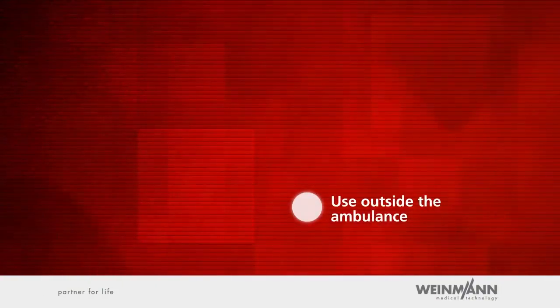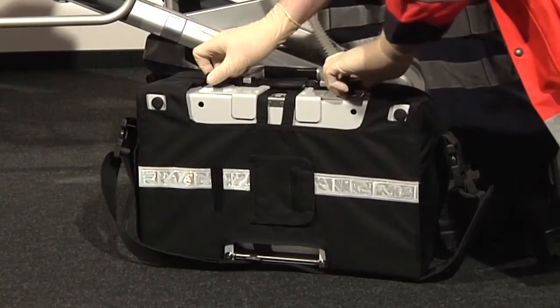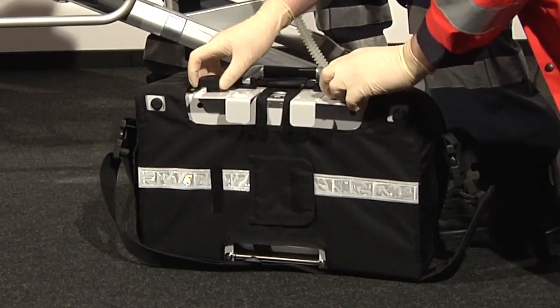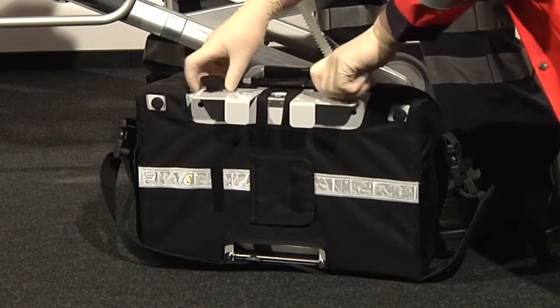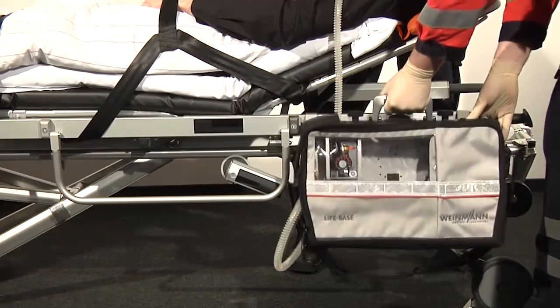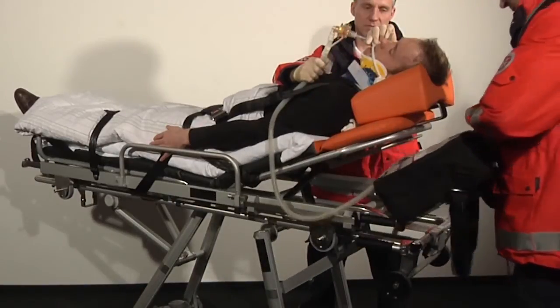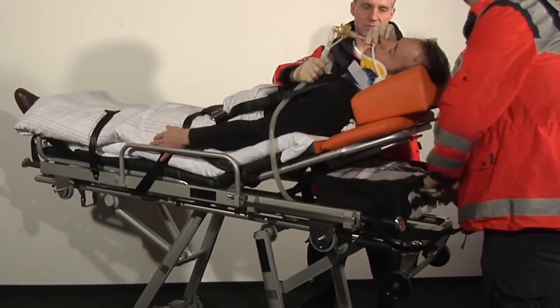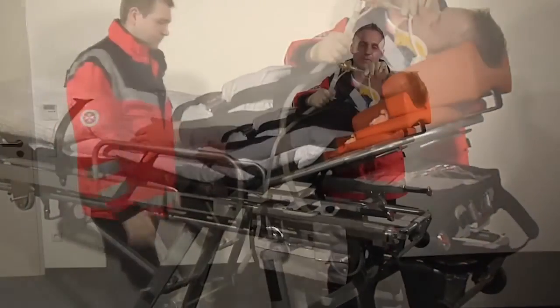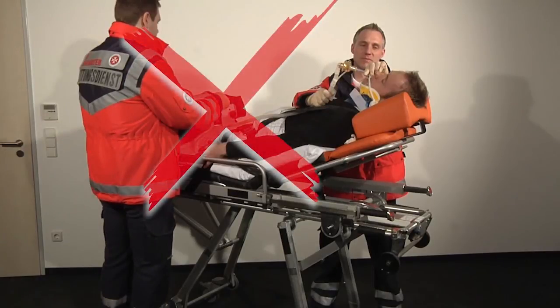Use outside the ambulance. LifeBase 3 has an extendable clamp to allow the complete system to be hung from a stretcher outside the ambulance. Always make sure to tighten the screws again after you have extended the clamp. Experienced users prefer to place the portable system at the head of the stretcher when the patient's upper body is elevated. To avoid injury, do not place the LifeBase 3 portable system on or between the patient's legs.